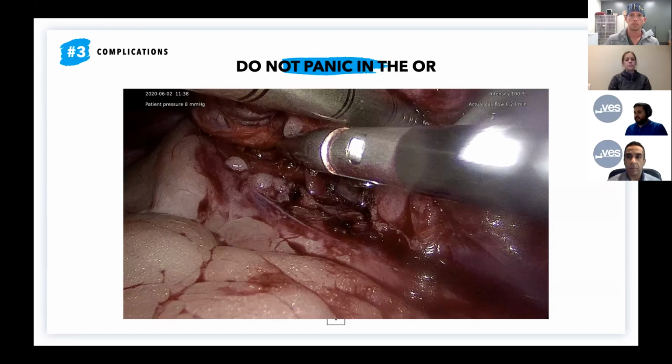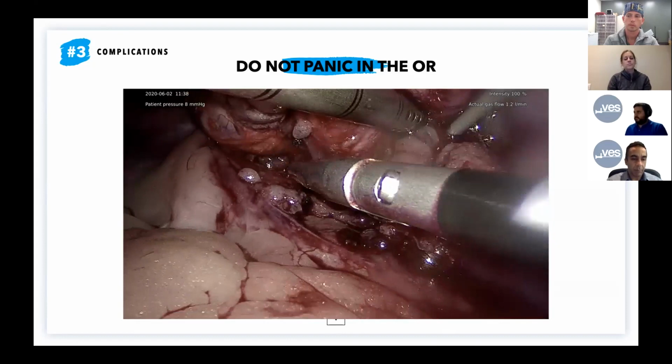And generally speaking, the ones that I've converted, I get in there and I've got four pairs of hands retracting the pancreas. Not that I regret converting, but it's always a mess when I go in there. I much prefer to do these cases laparoscopically if they're non-invasive. So here's a nice one. We got all the toys in the world, but the toys don't always work.